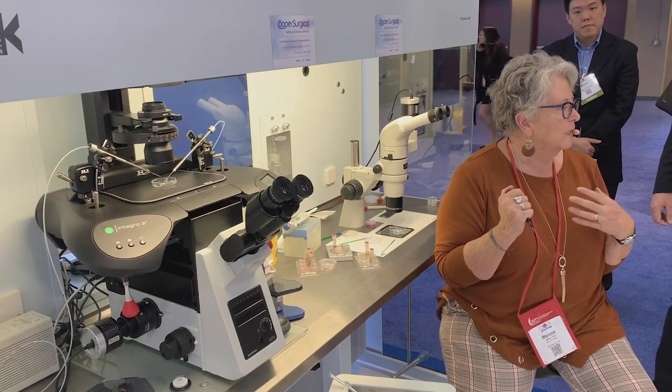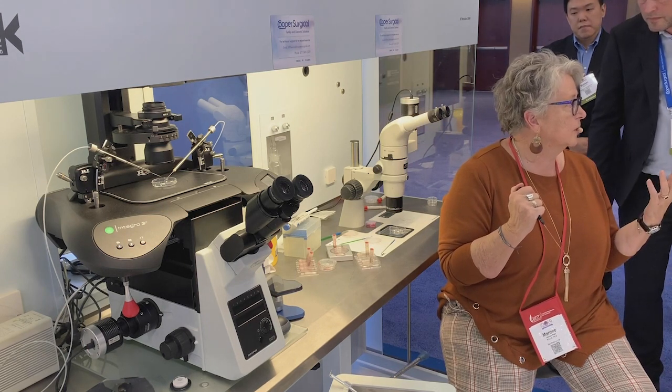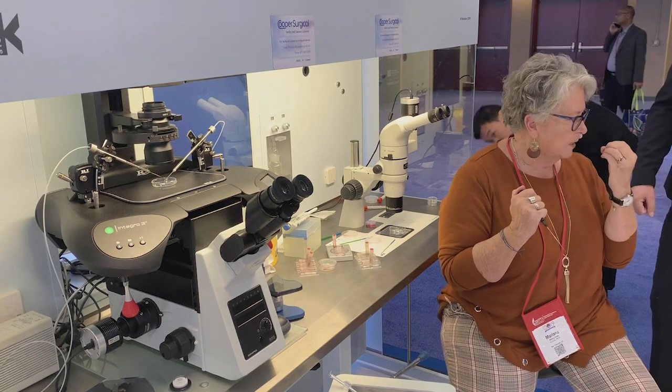Until you really learn how to do this, it's amazing how transparent they get when they first go into that equilibration solution. So don't have a tight, dark focus.